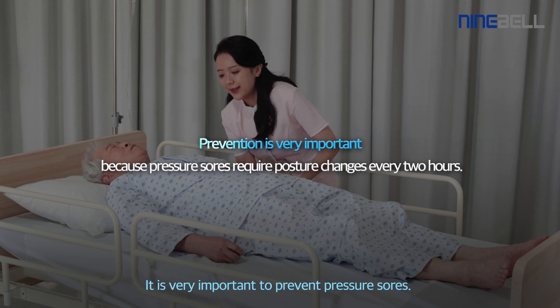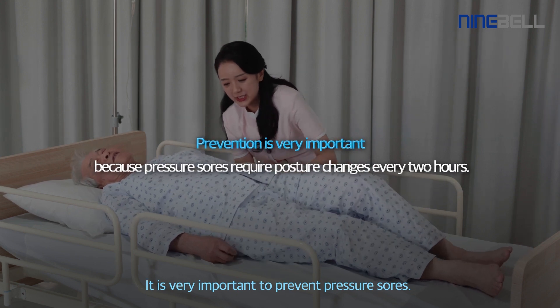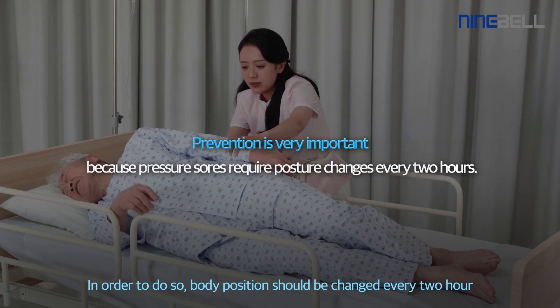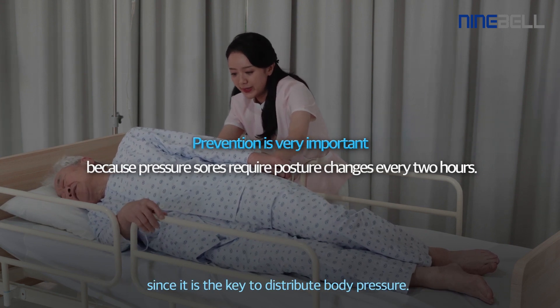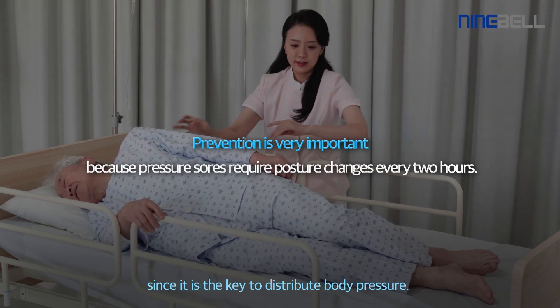It is very important to prevent pressure sores. In order to do so, body position should be changed every two hours, since it is the key to distribute body pressure.